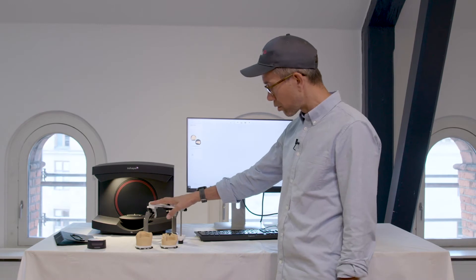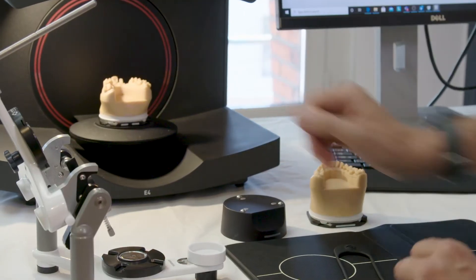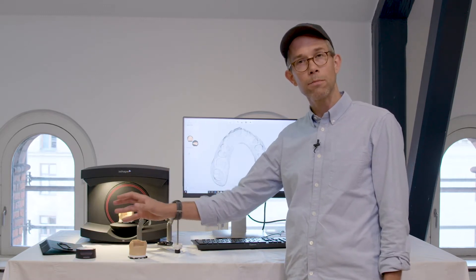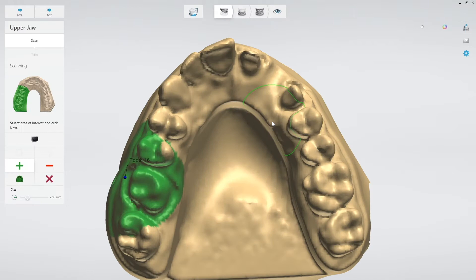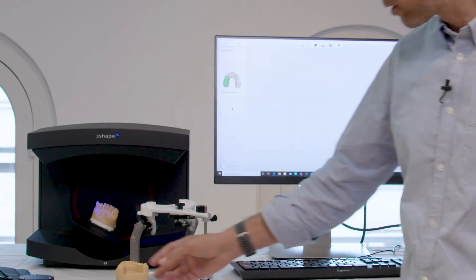I have an articulator all set up. I have the preparations in these models and I start placing them. With the e-series scanners, they have auto detection — meaning every time I load a model into the scanner and remove my hand, it will start. So less clicking. I choose my area of interest and scan. I already have my antagonist lined up.